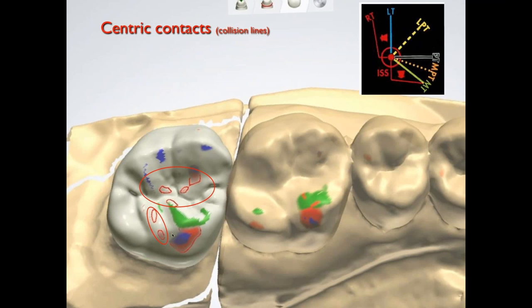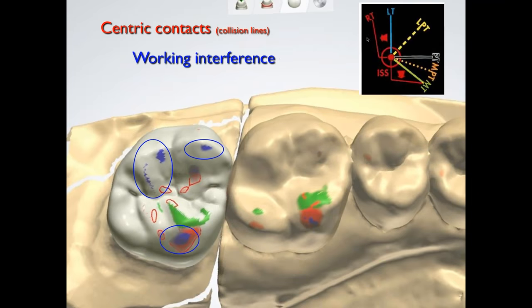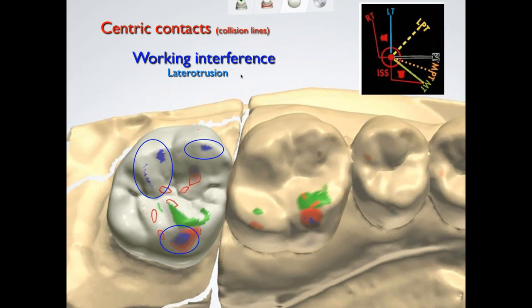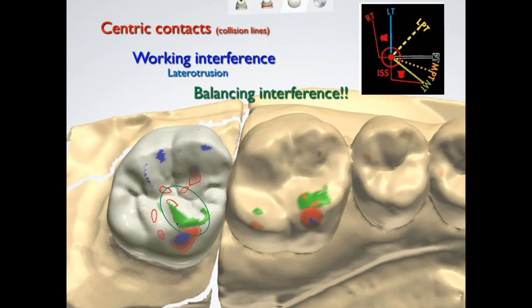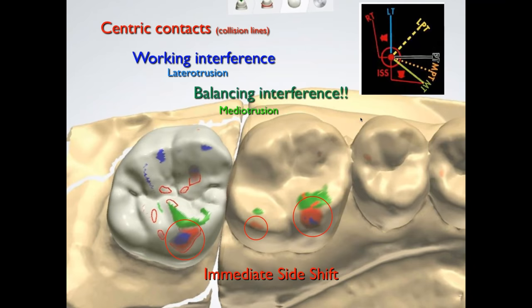The blue is a working interference — lateral movement. There's also LPT (lateral protrusion) in yellow, which I've never actually seen. I really look for blue to know when I've got a working interference, also called lateral protrusion by 3Shape. Green is a balancing interference — mediotrusion — and MPT would be a medial protrusion, an in-between movement. There's also an orange color I've never seen. Then there's ISS in red — immediate side shift — which looks to me more like broad centric: the area of centric contact you'd get if you ground the models around in the neighborhood of centric.